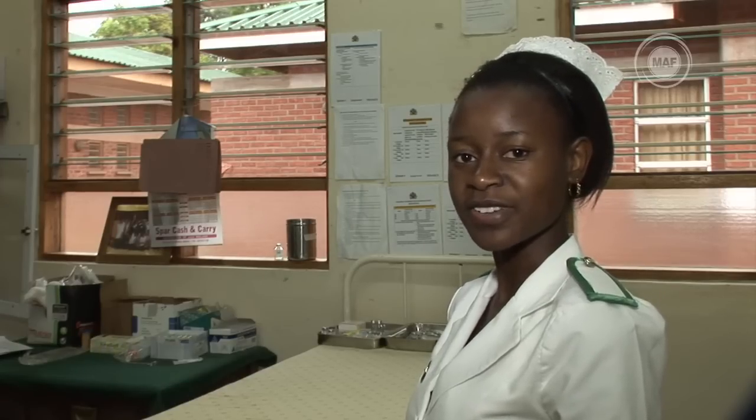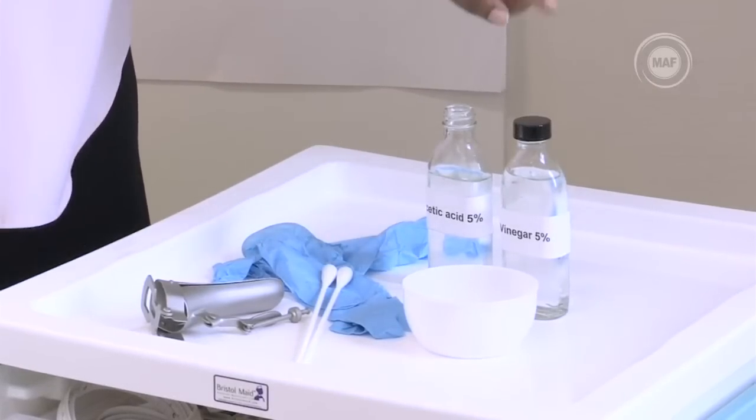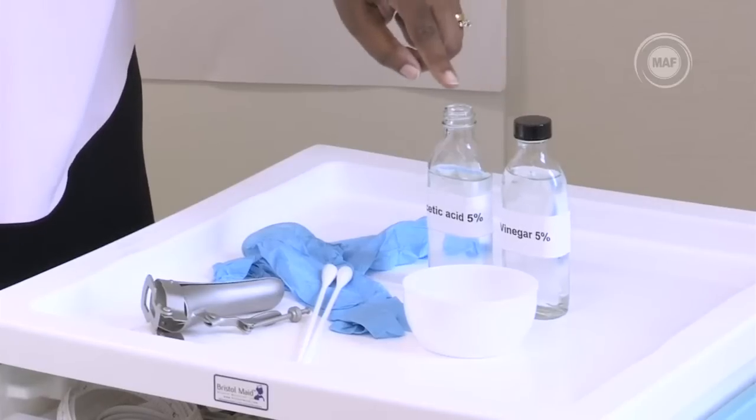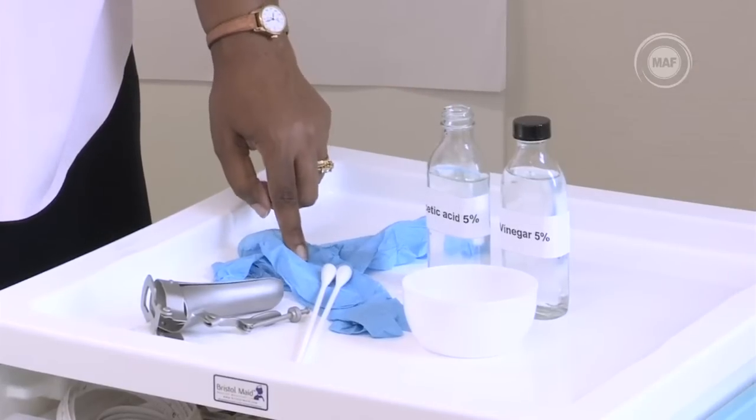Can you give a step-by-step explanation of how to do a VIA? First you need to prepare your equipment and examination room. You'll need a light source, cotton swabs on a stick, a small container, 5% vinegar or acetic acid, gloves, and a speculum.